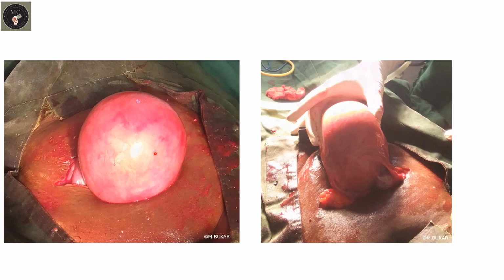In fact, it was soft in consistency. Posteriorly, you can see the ovary here, the tube, and the fundus somewhere here. So this was what was seen on ultrasound scan with features of degeneration.